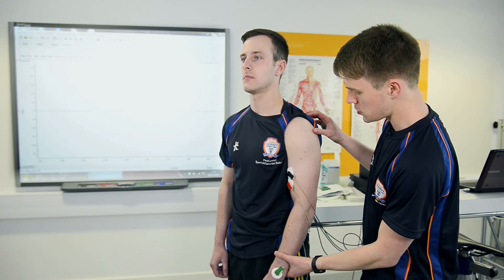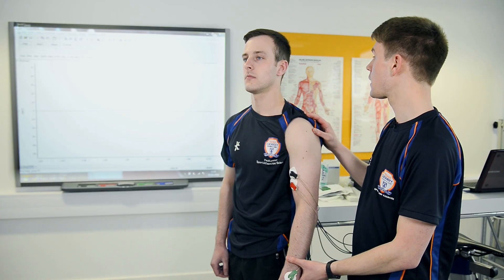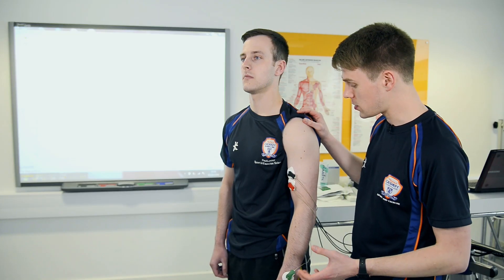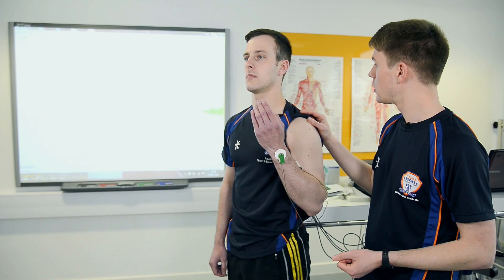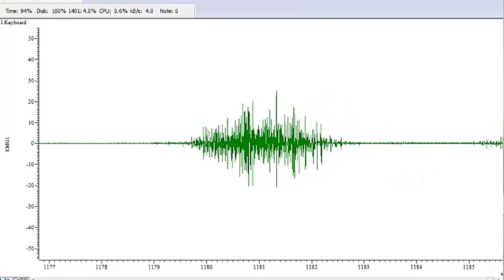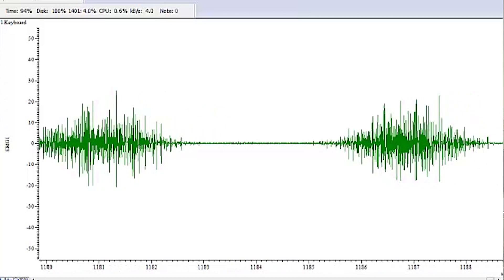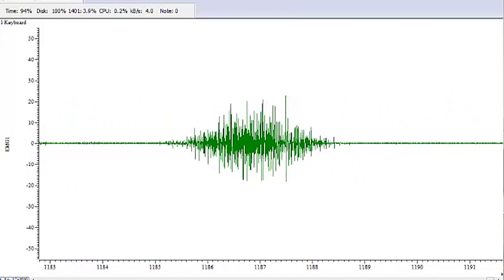Here on the screen, I'm showing Paul's biceps EMG. At the moment, the line is flat, and that shows his arm is relaxed and no motor units are firing. However, as soon as Paul makes a movement with his arm, you can see that an EMG trace appears. This shows that motor units are firing in order to generate that force.